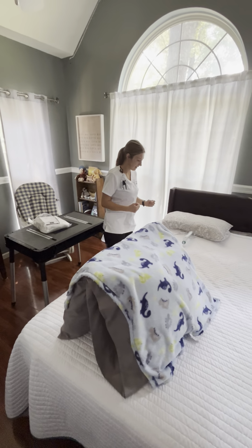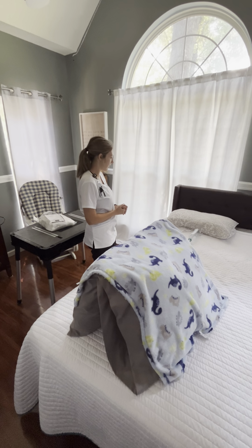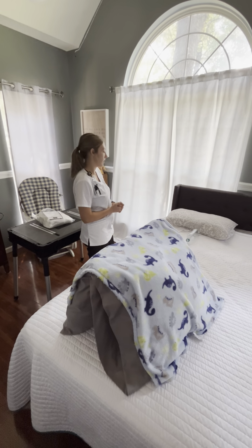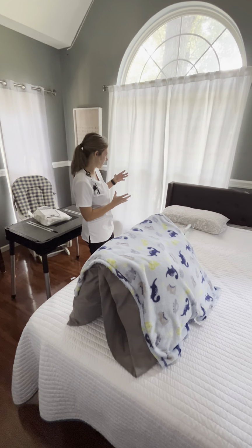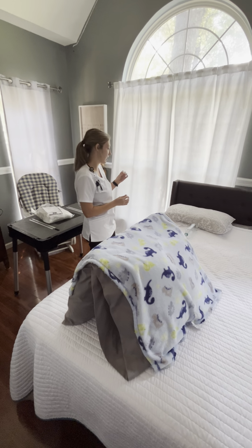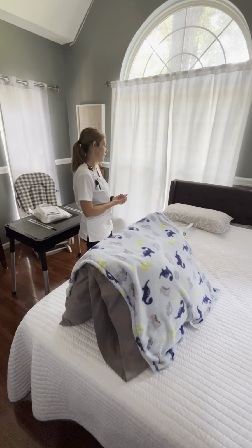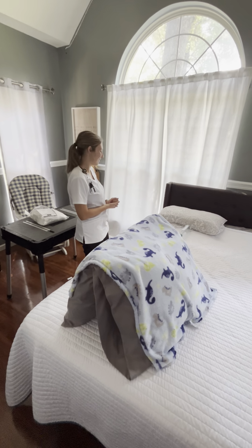Thank you, Miss Smith. All right, I got an order to do a Foley catheter today. Do you know what that is? No? So a Foley catheter is just a tube that's going to go up into your bladder to just drain that urine that's just been sitting there. It's just going to drain that urine that's been causing you to have a UTI. Is it okay if I do that today? Okay, thank you so much.